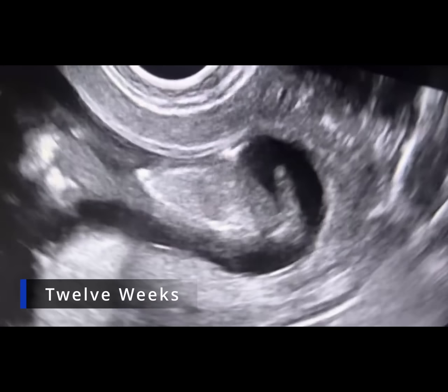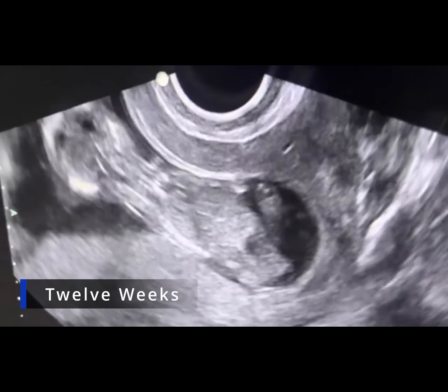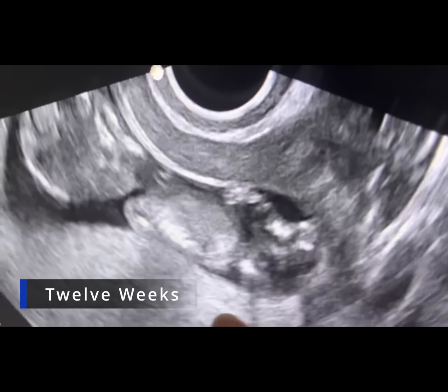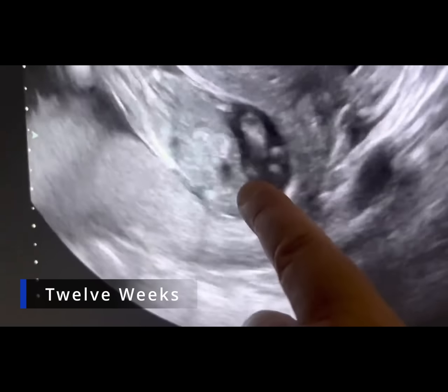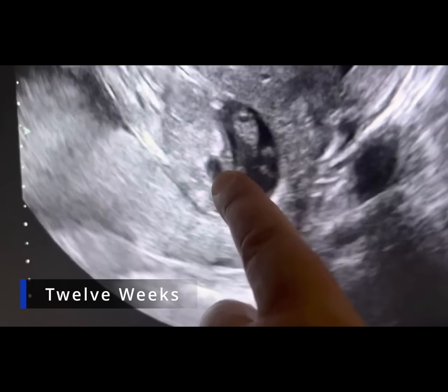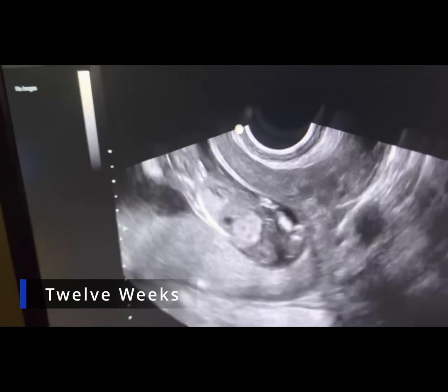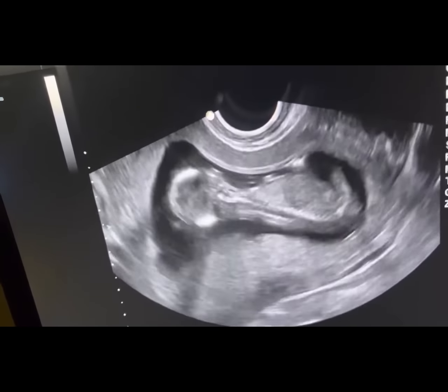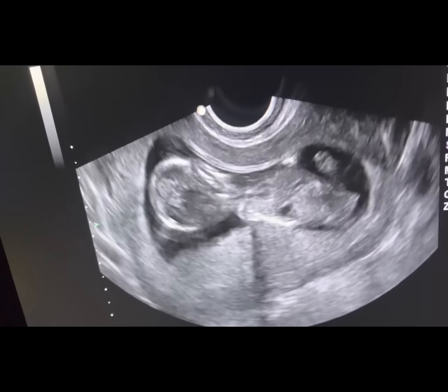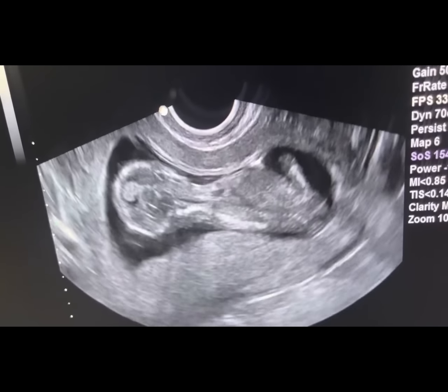We go down into the abdomen now. Look at that spine all the way down into the abdomen. The internal organs are starting to form. We might even be able to see the bladder go through there, Amanda, right there. We'll keep going. Right there's bladder. And we've got umbilical cord. So if we go back to look at the fetus overall, there's a beautiful human fetus at over 12 weeks gestation. Spectacular.